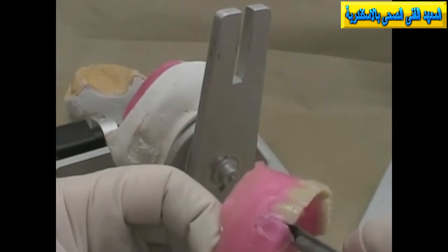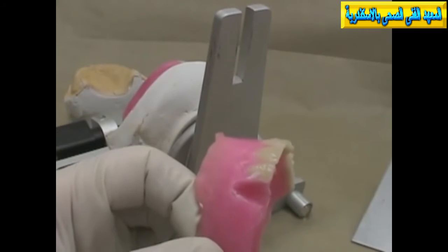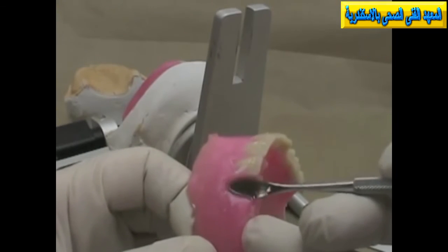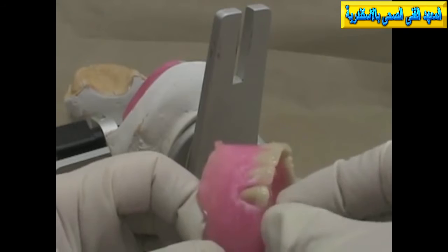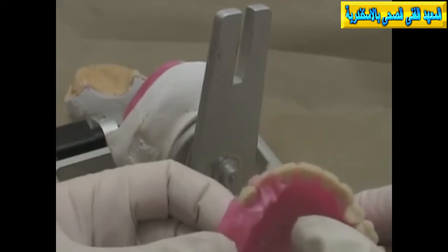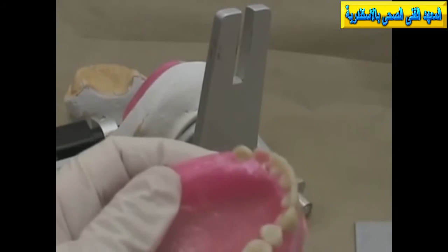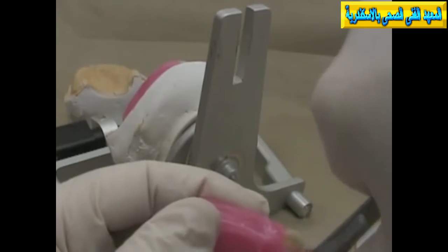Next, we're going to remove some wax and set the last of the anterior teeth. Again, making sure that we've got the proper axial alignment and the position of the incisal edge. Remember that for the canine, the cervical portion's tilting backwards, so the cervical portion is slightly distal, not dramatically so, but a little bit, and also that the neck is a little bit more prominent when we're setting that. Okay, so when you look from above, you should see the prominence of that neck. We're also going to take away a little bit of this wax on the lingual surface so it's easier for us to move the teeth where we want. And again, I'm using a finger rest whenever I'm using my knife.